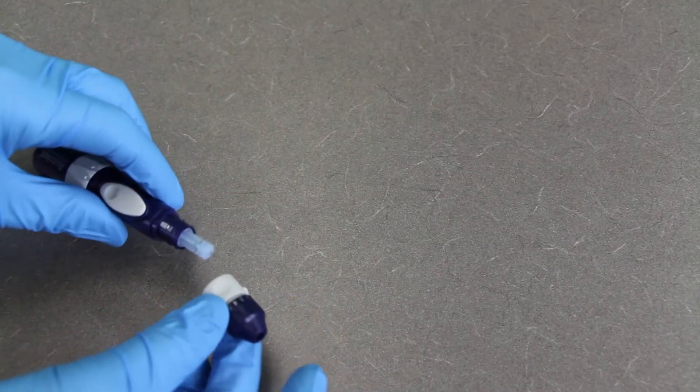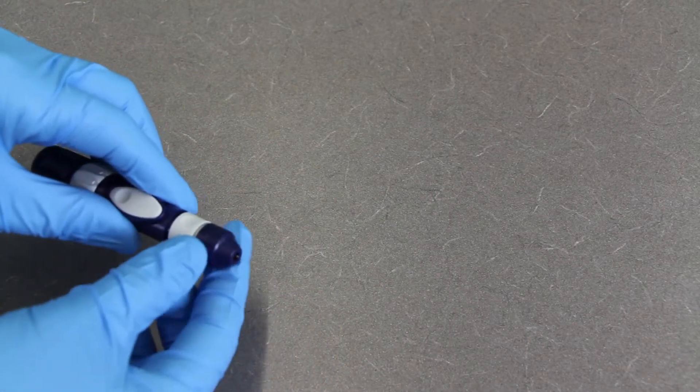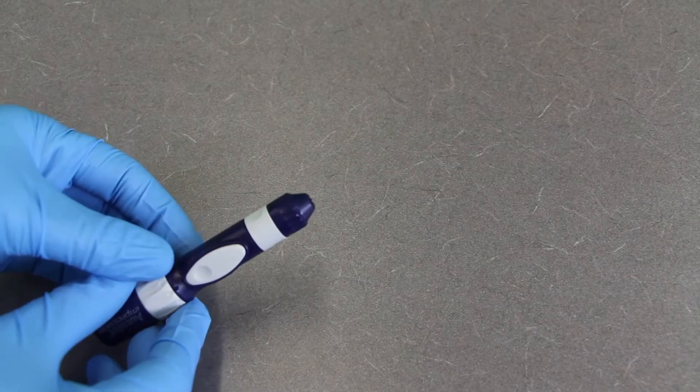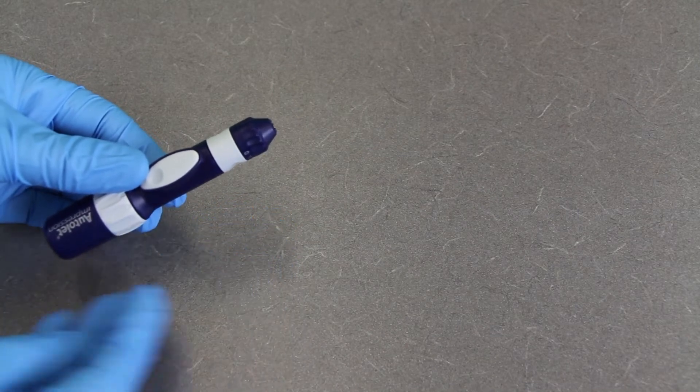And then what we're going to do is we're going to very carefully put the top back on the lancet gun. Okay, so the lancet's in. I took the top off of the needle so the needle is exposed.